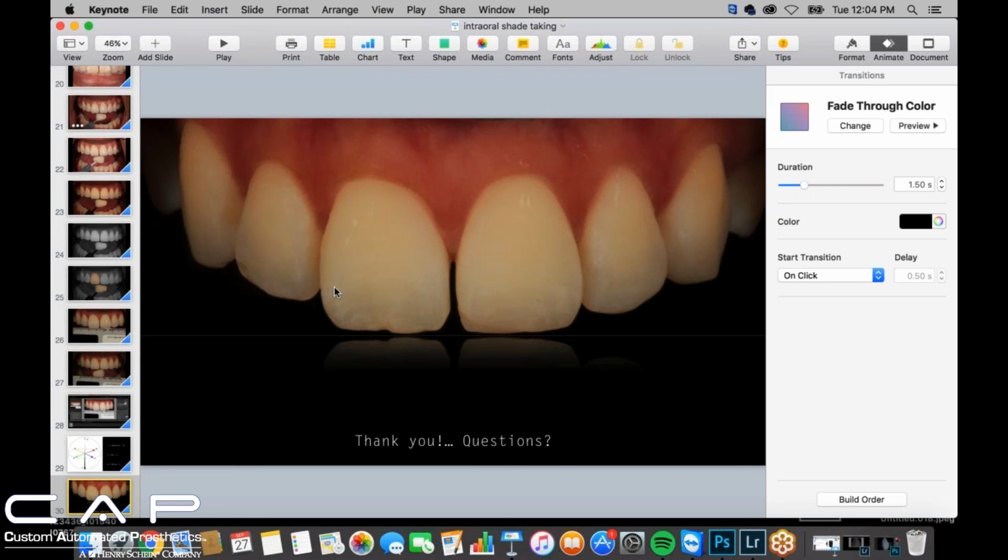If that's what you mean, the best way for me to pick up those modifiers is to simply use whatever ceramic system that you're using. I go through those, and if it's a gray or clear or blue or opalescent, I find those shade samples that I have, and I'll simply take a photograph with that specific shade tab or ceramic tab in the photo next to the effect I'm trying to match.